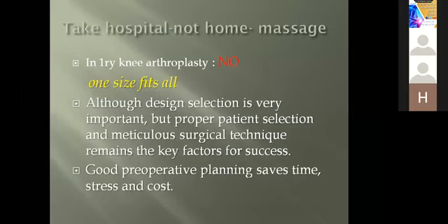In primary knee arthroplasty, there is no one size fits all. Although design selection is very important, proper patient selection and meticulous surgical technique remain the key factors for success. Good preoperative planning saves the time, stress, and the cost for the patient and the surgeon.